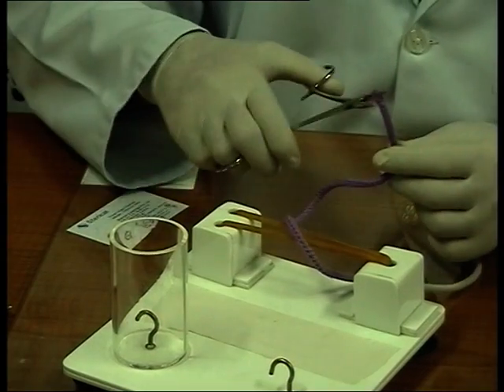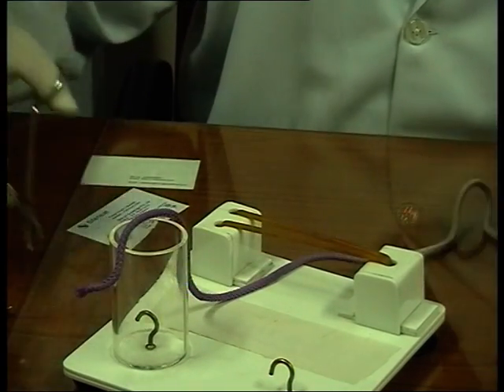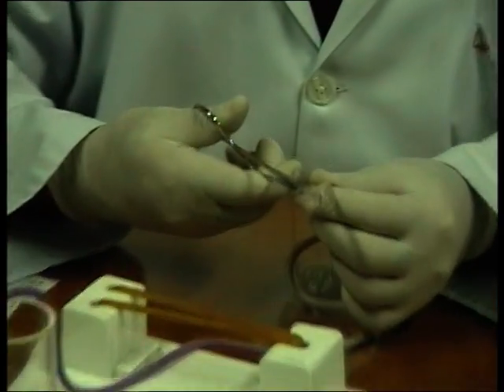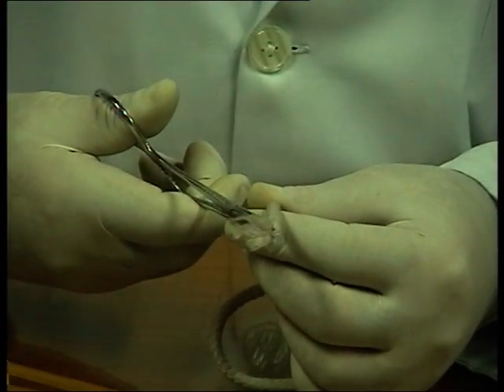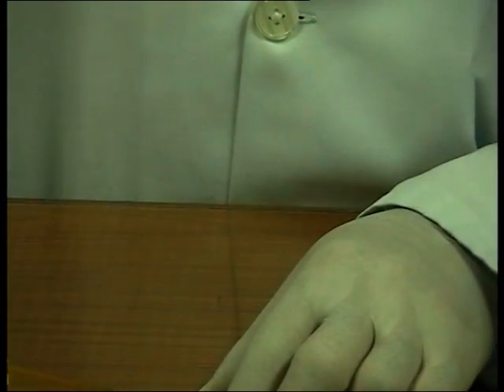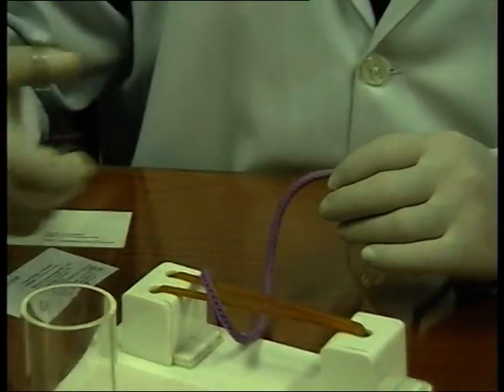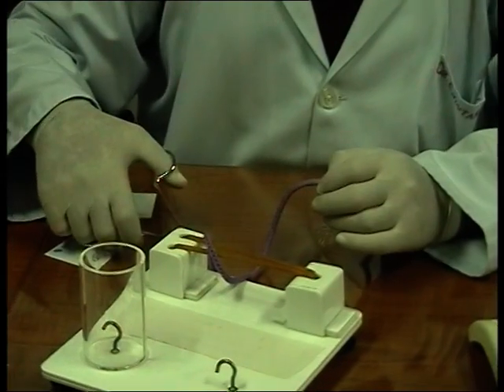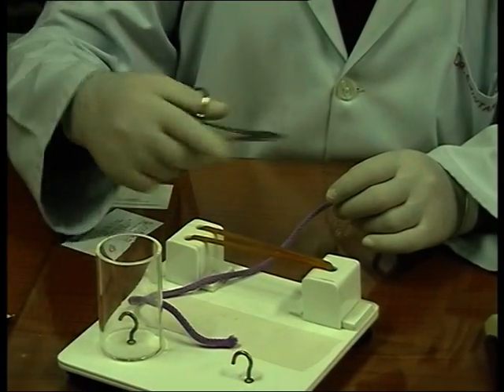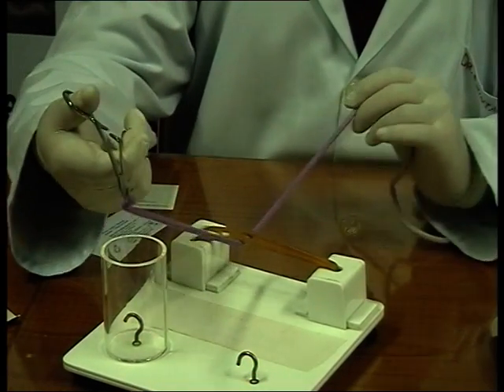This instrument, although you're supposed to use it for suturing, and the needle should be here. And ideally the needle holder should be holding the needle. So that's the safest place for the needle to be. Now remember, you keep doing instrument ties. I'm sure you all must have done some suturing here and there during internship. Now when you do suturing, you use instruments for tying. And you learn that you go clockwise and then anti-clockwise. It doesn't work that way. That's not the principle of knotting with instruments.